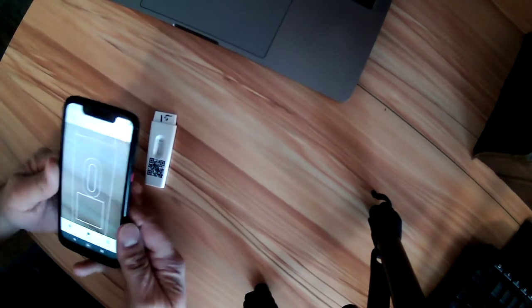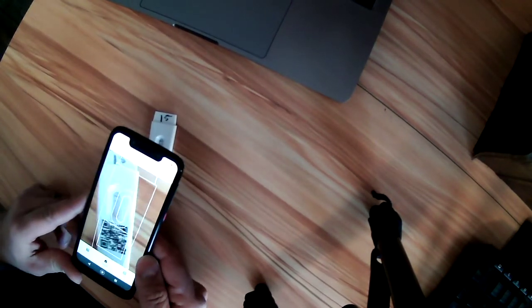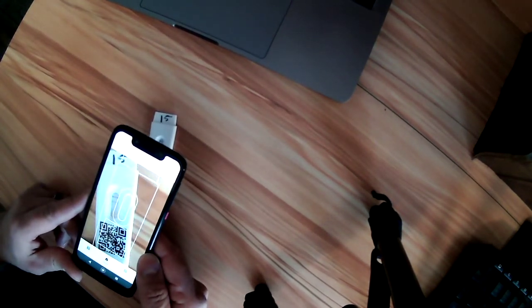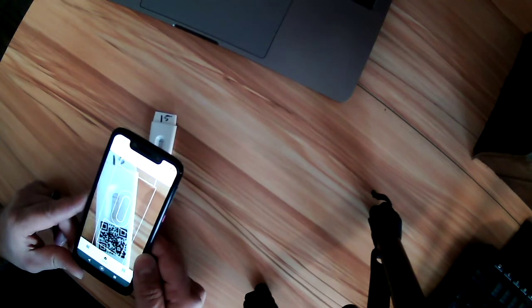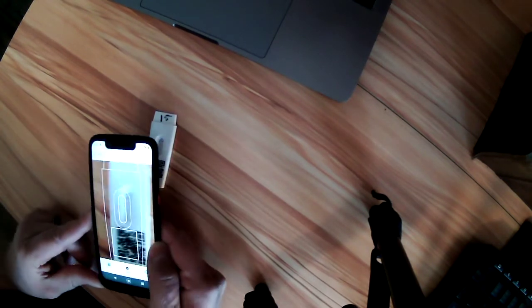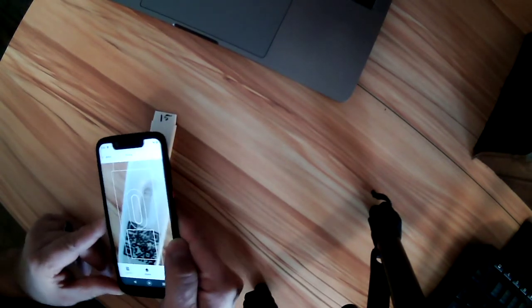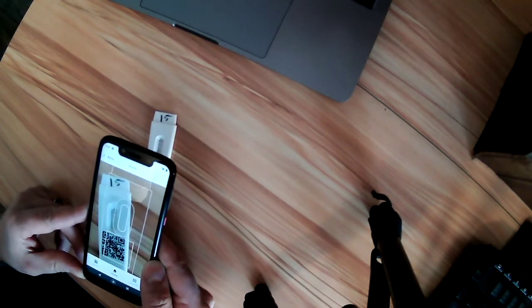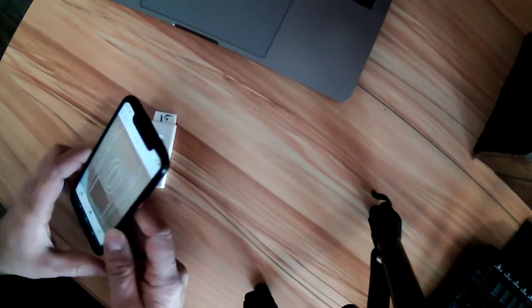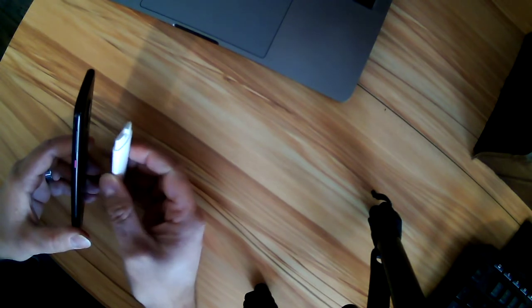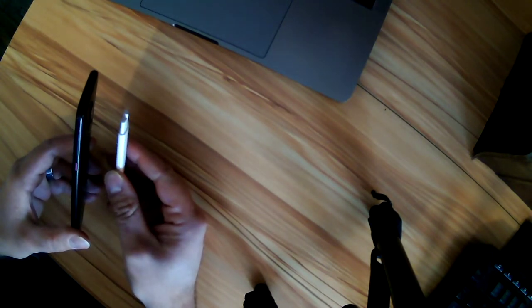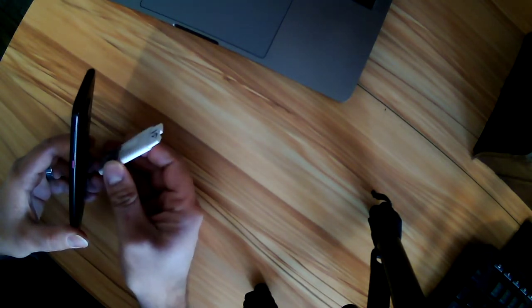When you go to scan the test it's important that it's not rotated side to side. You want to make sure that you get it as straight as possible and also make sure that the phone is parallel with the test. If it's like this that's no good, likewise if it's side to side that's also not going to let you scan.